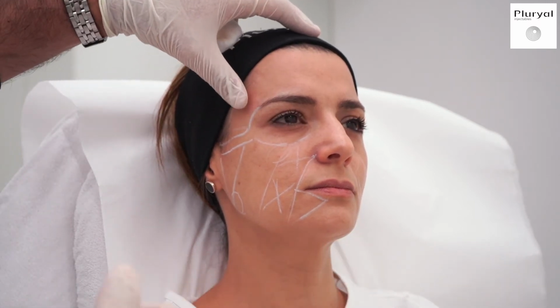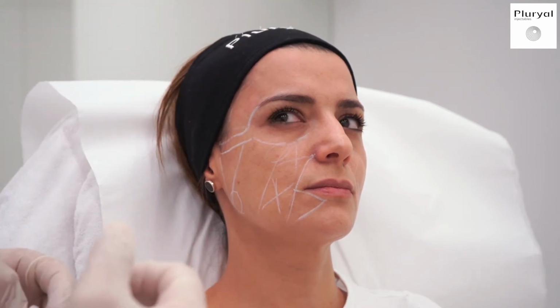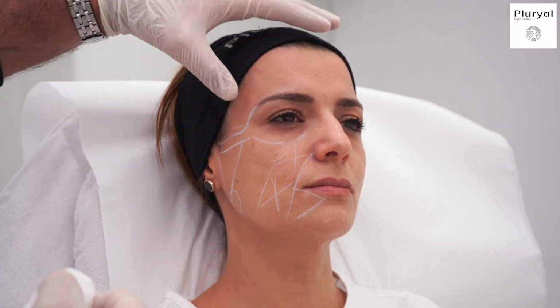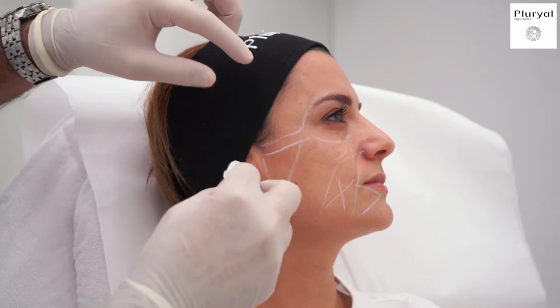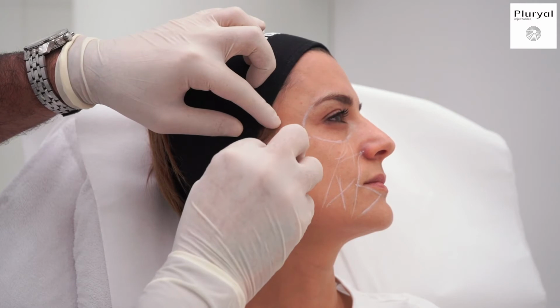You can massage it a little bit, and you always have to tell the patient that they will be feeling pain tomorrow and the day after, whenever they open their mouth. After doing the temporal area, I will be doing the zygomatic arch.